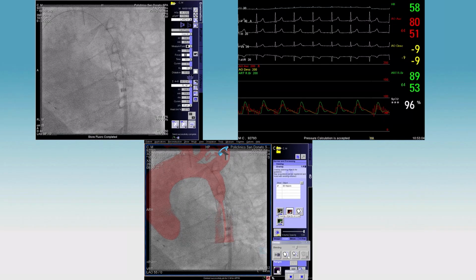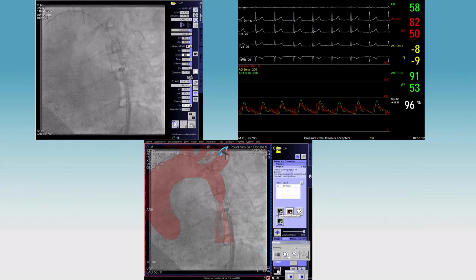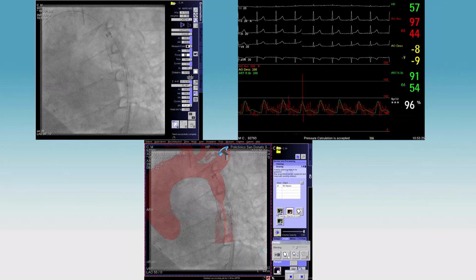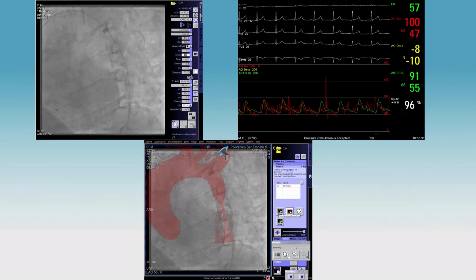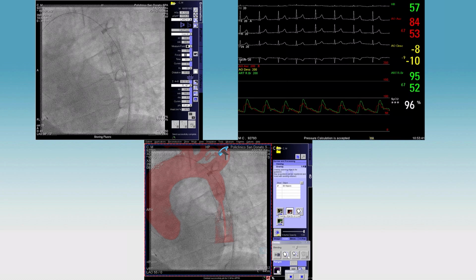So keep the balloon there. Just advance the sheath over it at the moment, because we might need to reinflate. And the balloon sometimes gets winging, and it can be difficult to pull in. But Luca's doing a very good job there. Okay, so if you hold the sheath, and I'll pull the balloon down. Contrast in syringe. 20.